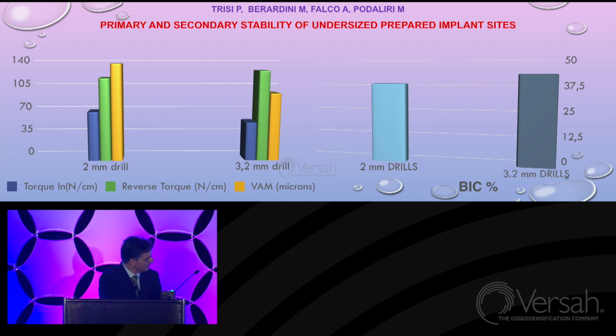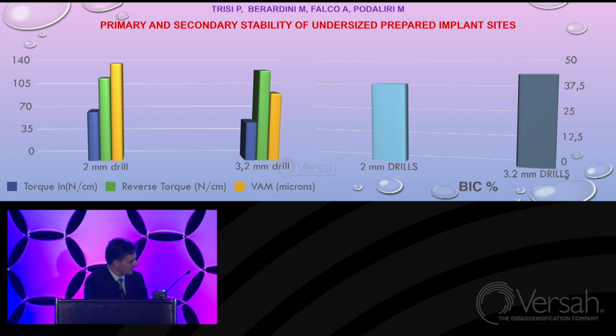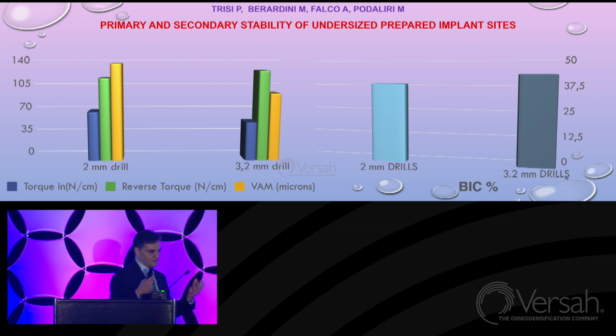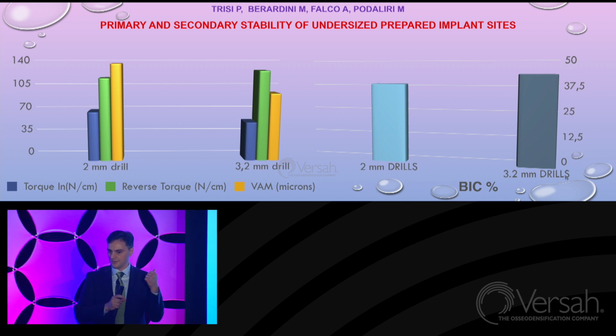And you can see that insertion torque for the 2 millimeter drills, of course, was higher than insertion torque for the 3.2 millimeter because the hole was tighter, was smaller. Reverse torque was quite similar, not so different. In the 3.2, it was slightly higher. The micromotion for the 2 millimeter drills was higher than for the 3.2 millimeter. What does it mean? Sorry for the numbers, the graphs are always boring, but there is very important information in this slide.